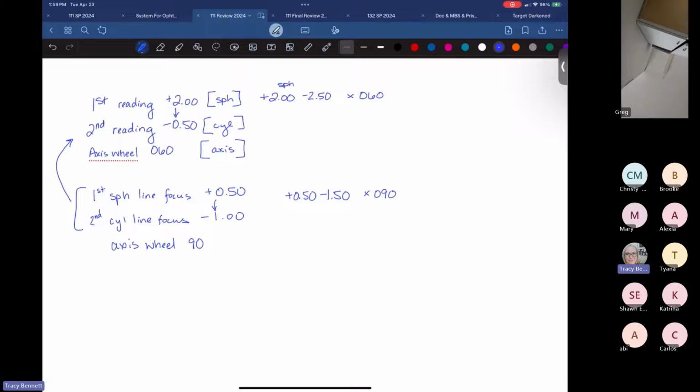Let's see. If you have a segment lens, then you want to make sure that, so there's our OC here, right? Then you want to make sure that your lens clock is held at the distance, yes, in the distance, and you want to make sure that it's kind of along the 180 so that you stay away from that seg, because you remember the curvature of the seg is how we get that add power. So you want to make sure that you're clocking this up here, the surface, the distance point, so that we can get that base curve.